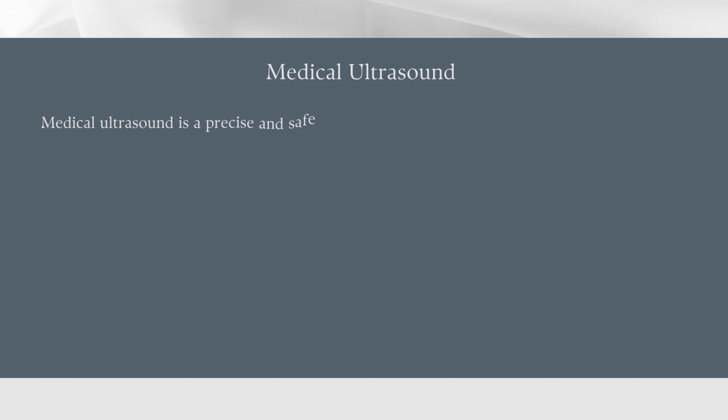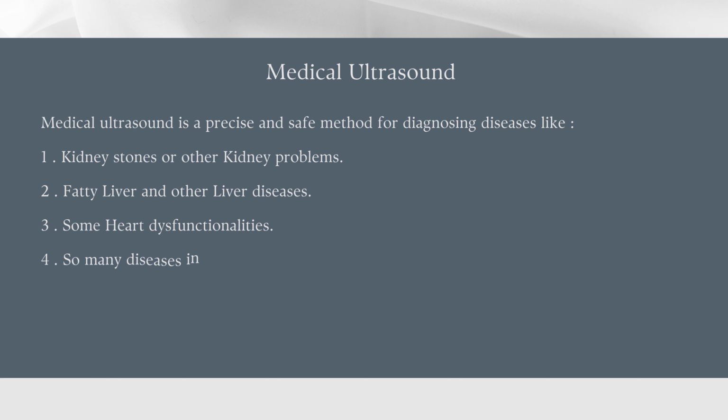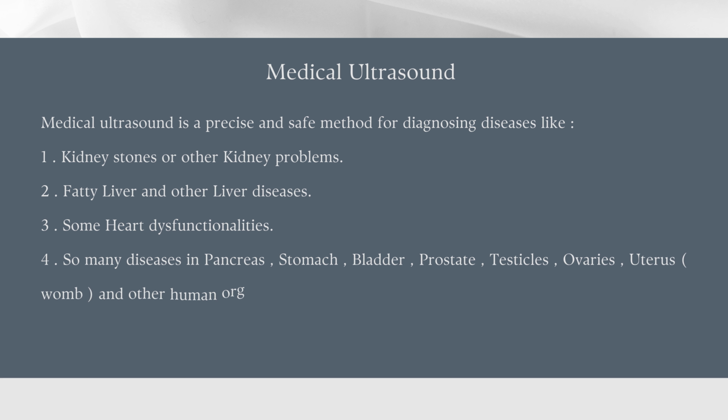Medical ultrasound is a precise and safe method for diagnosing diseases like 1. Kidney stones or other kidney problems. 2. Fatty liver and other liver diseases. 3. Some heart dysfunctionalities. 4. So many diseases in the pancreas, stomach, bladder, prostate, testicles, ovaries, uterus or womb, and other human organs.